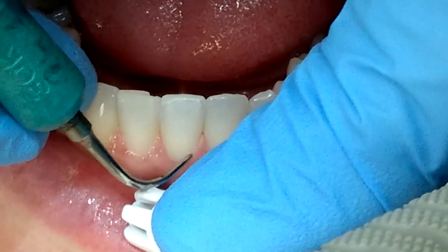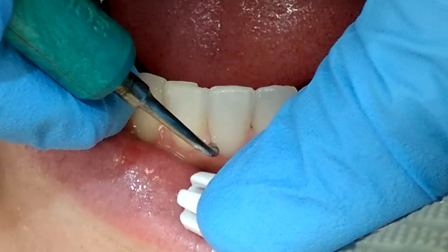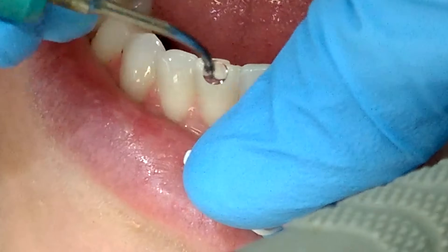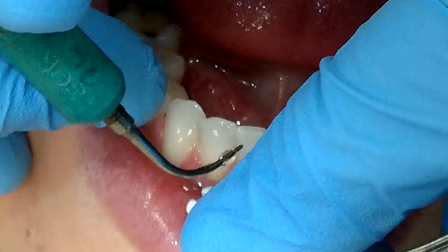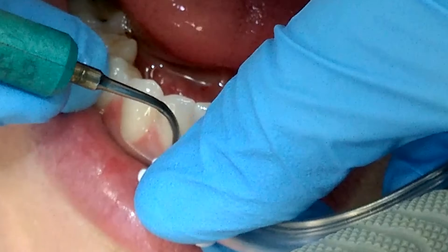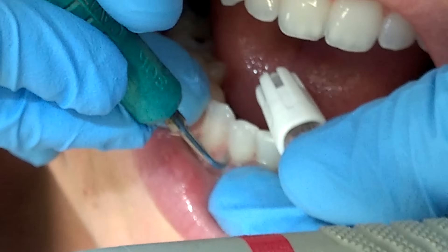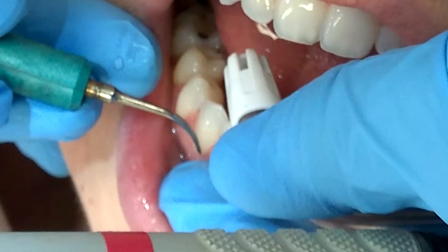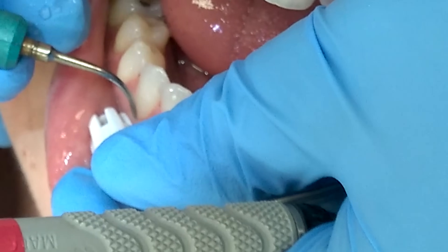It's very important to regularly check the length of your ultrasonic tip, because over time the instrument actually does shorten as you use it, which reduces the efficiency. When you get the instrument tip, the instrument company will generally send you a guide that allows you to check and make sure your tip is long enough and that you're being effective with it.